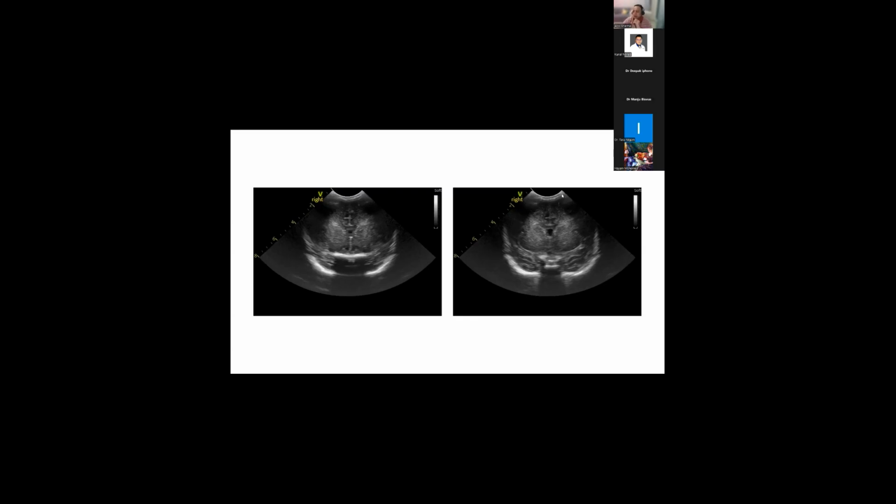As we move back, can you see how the anterior part of the fontanelle is very narrow? So actually my probe is struggling. But as I move back, I start getting more of the cerebral hemispheres and I can start seeing tissue a little bit better. Again, still with a little bit of dropout. But as soon as I move further back into the midline, what can I see over here? Anybody?